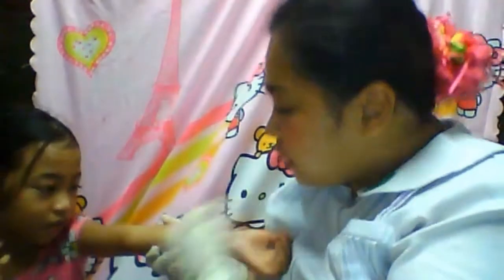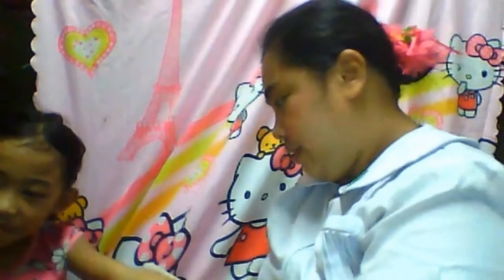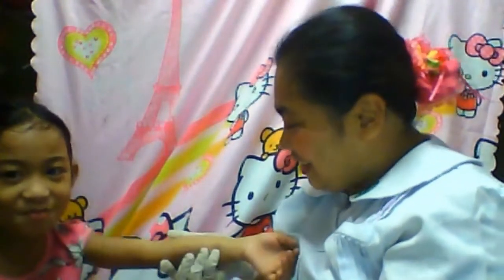Alright, so for example, what I have here is this area, just for example. So we will get a wet cotton ball and then wipe the area to be injected in a circular motion from inner to outside, one direction only.